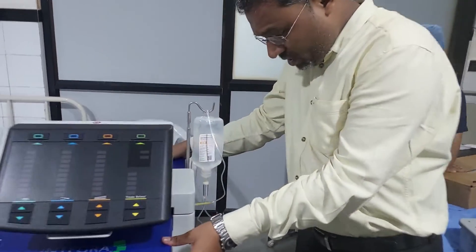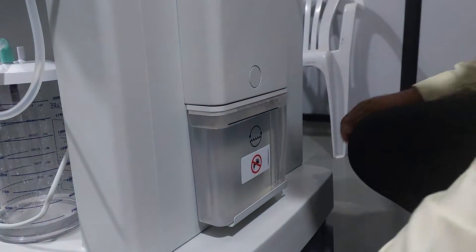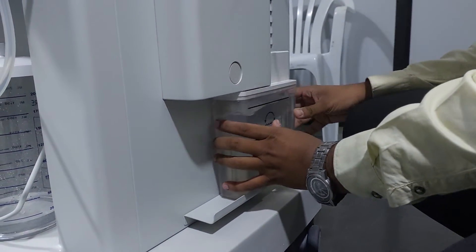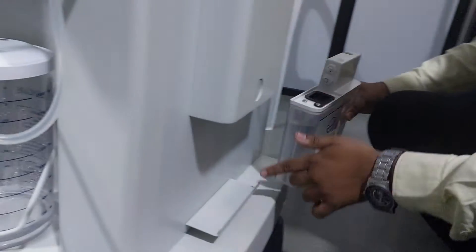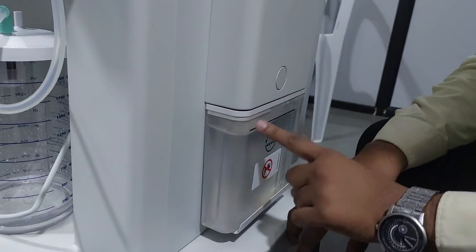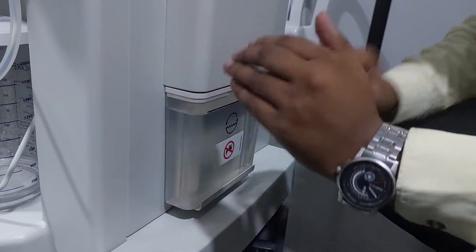They have provided one water chamber here. In this chamber, always use sterile water. To remove it, they have provided a knob — push this knob and press it to the left side. In this way you can remove it out. To drain the water, just remove it, drain it out, fill it, and close it properly. Put it in the given slot and push it — it gets fixed. Perform this practice after every seven days. If there is no surgery, keep it dry; before surgery, fill it.